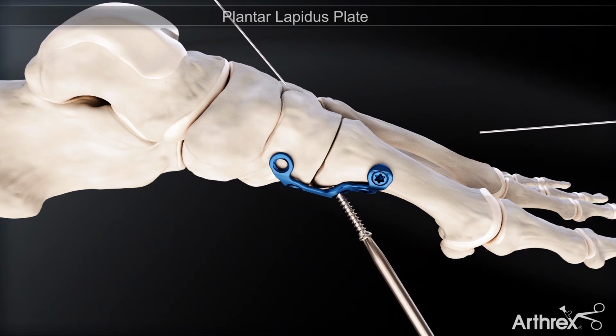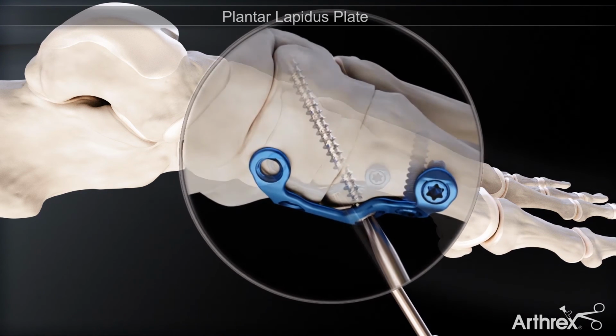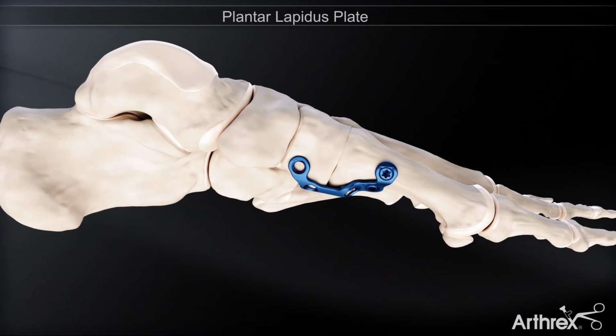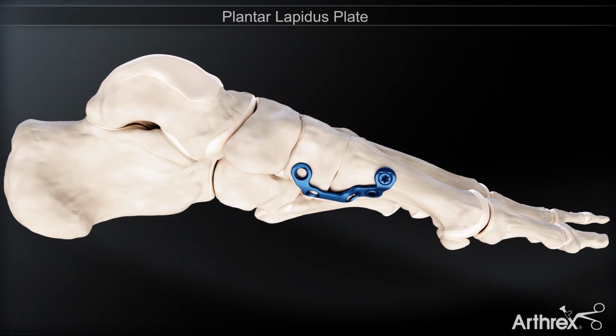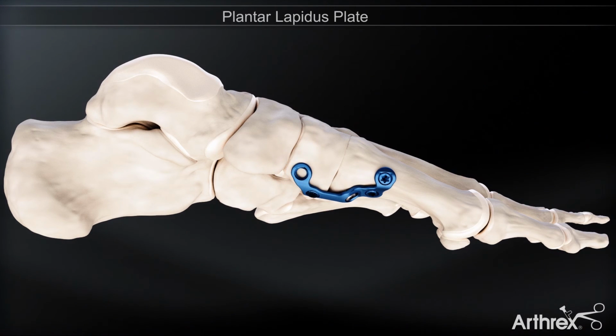plate. Remove the provisional K-wires and BB tacks before completely tightening down the screw in order to achieve maximum compression across the arthrodesis site. Follow the same technique for inserting the final two locking screws into the proximal aspect of the plate. This completes fixation of the arthrodesis construct.